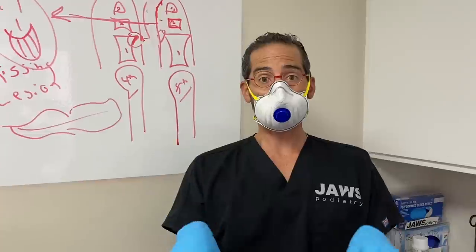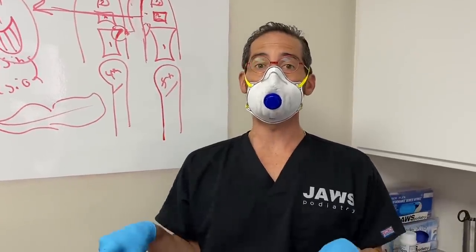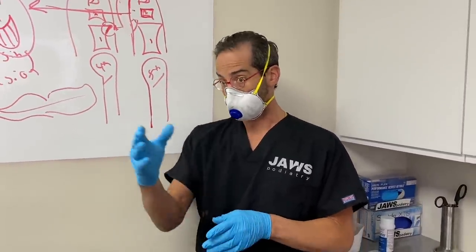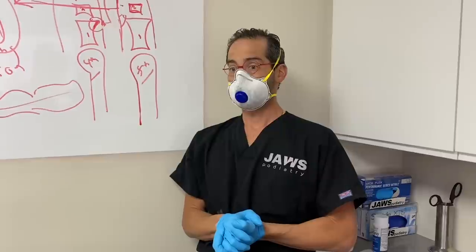Intractable interdigital porokeratosis — also known as an interdigital seeded corn — as a result of a bone spur. Extremely common. There are solutions out there, and we can fix this.